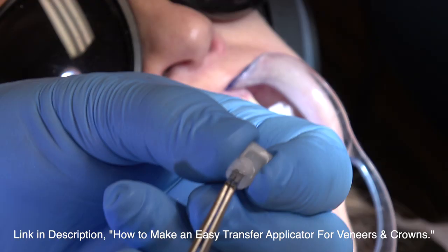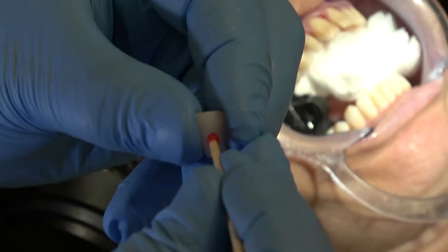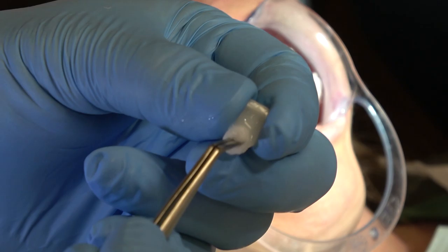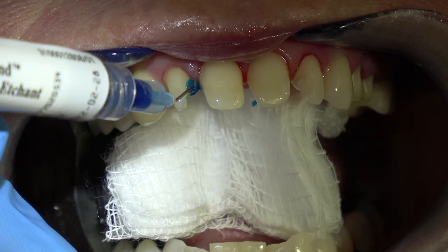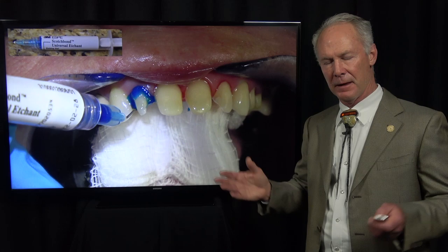Then I'm going to wipe these with isopropyl alcohol to clean anything off, and dry them. And this is an easy way to transfer the veneers. This is red rope wax on a cotton tip applicator. 38% phosphoric acid. Now, I don't use silane. You don't need it, and it can be a source of contamination, so you don't need to use silane.